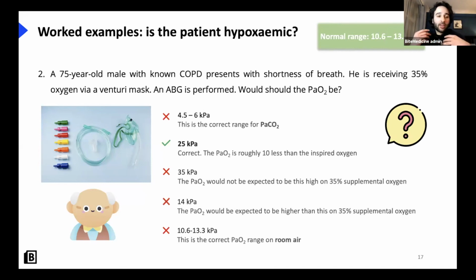If you give patients with COPD a ton of oxygen and they have a background of hypercapnia, that's going to make the condition even worse, and that's going to actually deteriorate their respiratory function. So we need to give them very specific amounts of oxygen, and that's why we use something called the Venturi mask. Now, a Venturi mask, as I said, is shown here.